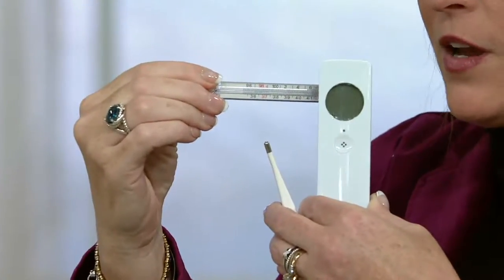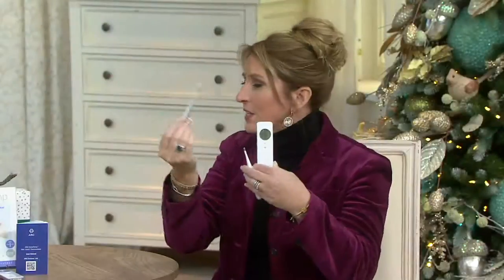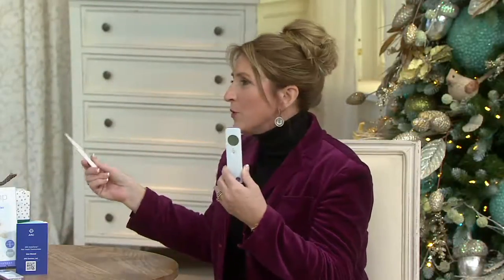Look how large our window is — this is an inch versus — I would never be able to read this. Plus it's glass; it's not safe. A lot of the other ways to take temperature require sheaths and are battery operated. With our InstaTemp, the battery is embedded in the unit itself.